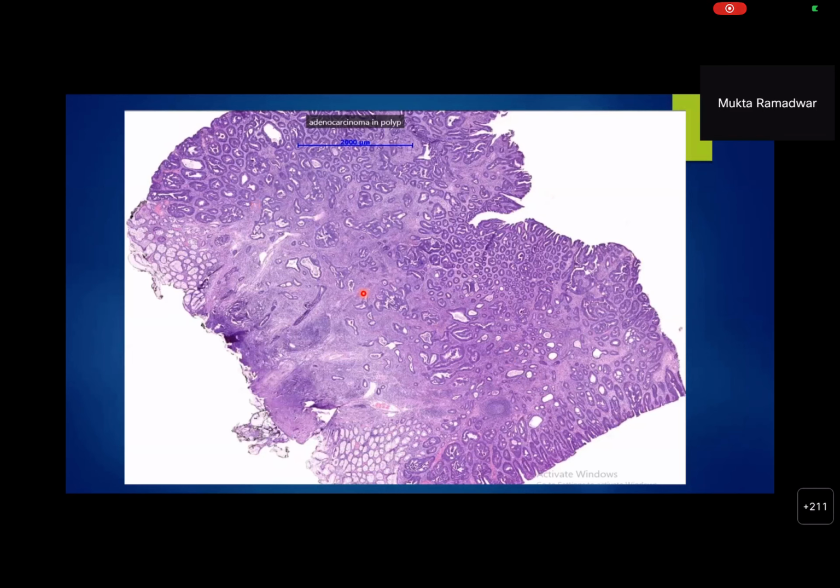And then Dr. Prachi just told you that they would resect the polyp along the mucosal margin. And what can you see here? Ink margin can be seen. Of course. So the ink, if the gastroenterologist has inked it, we have to reinforce that ink, and this is how it will be seen. But more than that, what can you see? What if the ink wasn't there? Like the glands invading towards the submucosa.